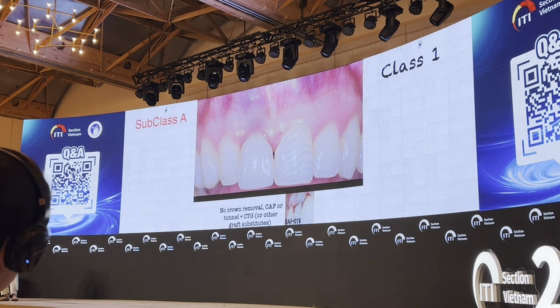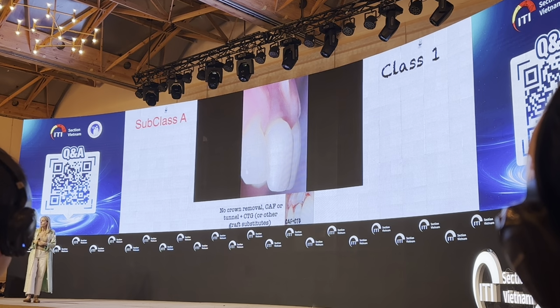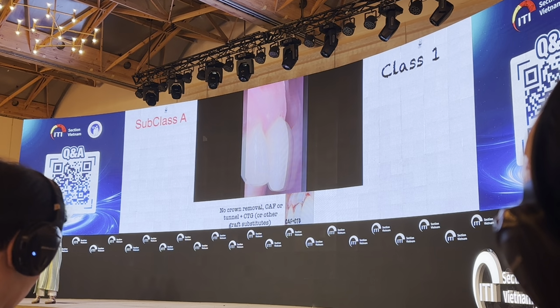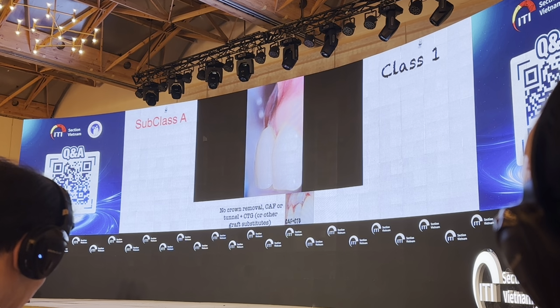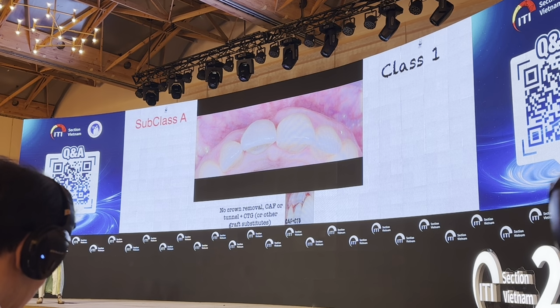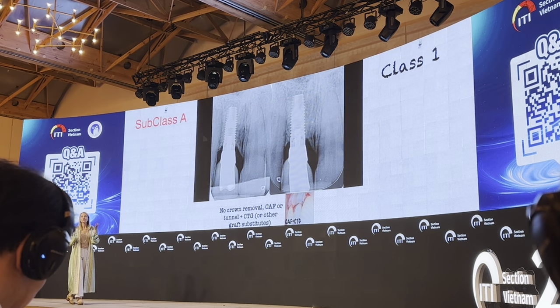I don't want the patient to touch it. And this is how the healing looks. Please look at the profile. You see, now it's completely different. And if you look, comparing the before with the after, on the distal papilla, look how it increased in volume.